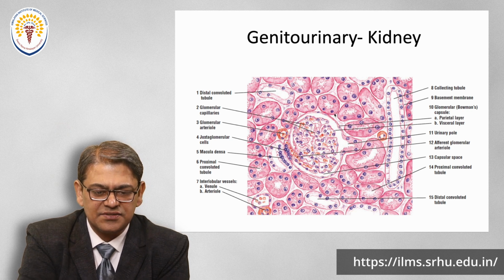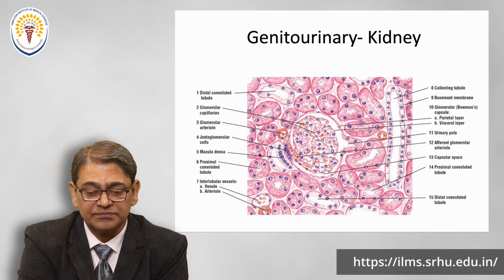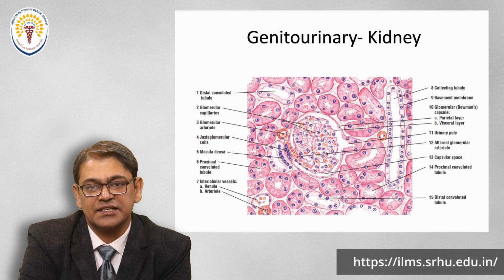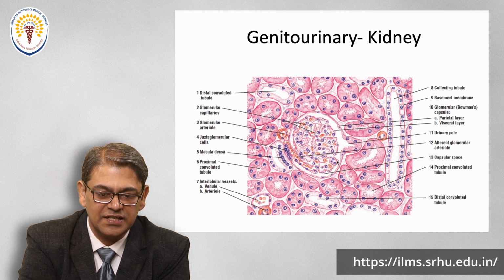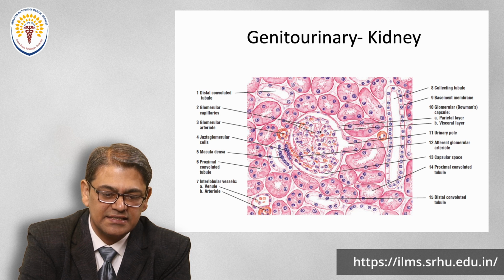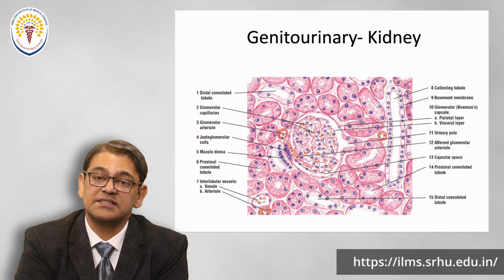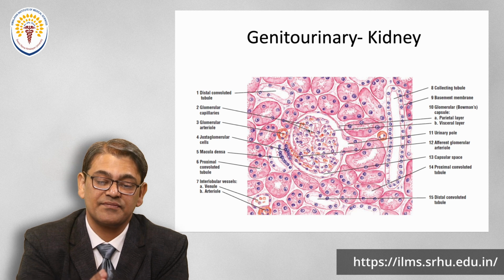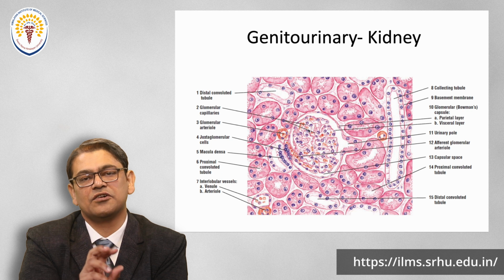Thanks to the Di Fiore atlas of histology, I have taken this slide from that atlas. This is the most beautifully depicted glomerular structure in the kidney. Can you see this? There is a squamous cell layer, the parietal layer, the visceral layer is also here, and then inside it is the histology of vessels. Now you see that it is a complex organ with various components like squamous epithelium and blood vessels, and if you combine them, that makes the histology of a complex organ.